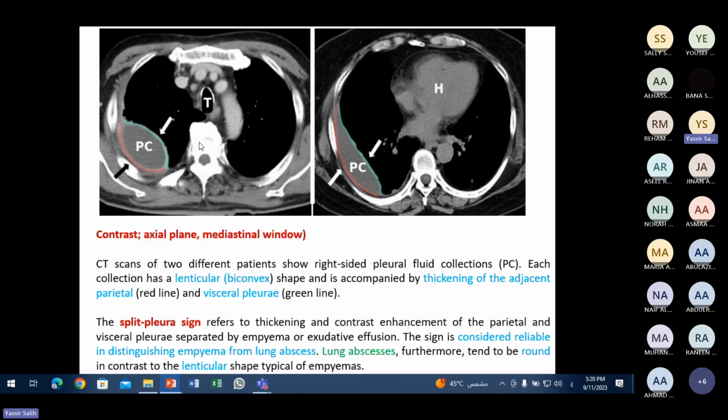نجي حقولنا CT can differentiate between lung abscess and empyema. empyema بكون حصل لنا infection in the pleural fluid, pleural effusion حصل لنا تكون get infected. فدائما بتكون لنا عندنا difficulties in differentiation between these two conditions. But this is CT for different patients. This is a CT for patient 1 and this is CT for patient 2. You can see this is a collection.